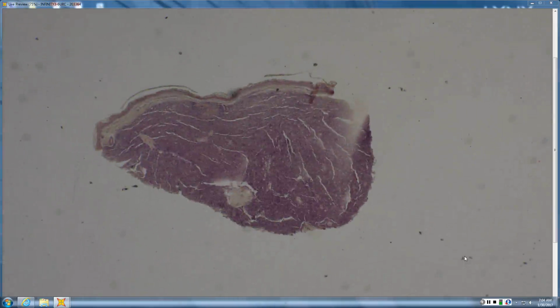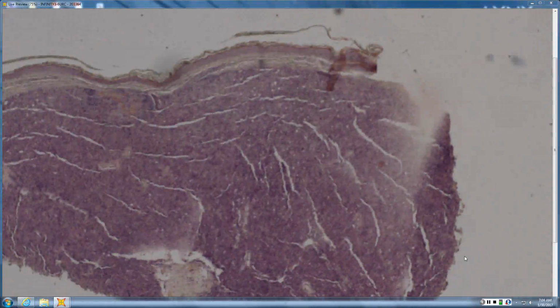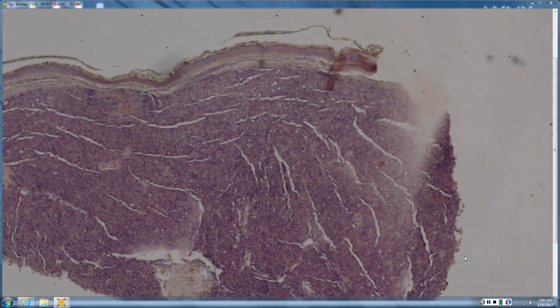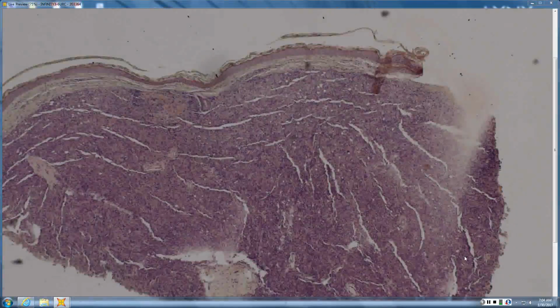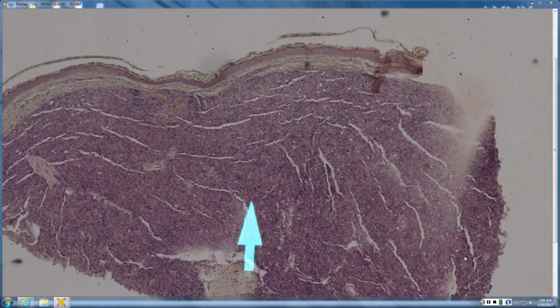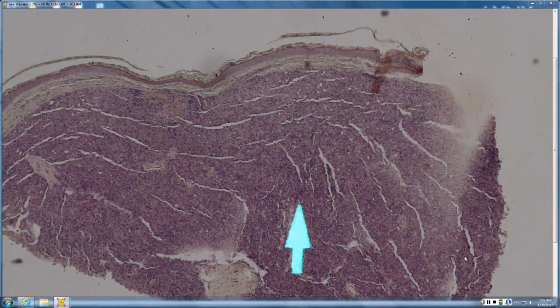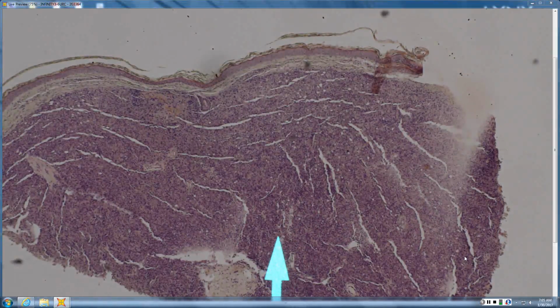So this is Leishmaniasis, and this is a great case of Leishmaniasis, meaning that you can really easily see all the organisms, but it's not always the case. Sometimes you have to search a little bit. Now, in this particular specimen, you can see why earlier I had mentioned Leish when there was that case of lepromatous leprosy with globi, because from scan, you're just seeing this diffuse lymphohistiocytic infiltrate, but then you do see some little tiny holes and little vacuoles, but even from here, they don't contain that kind of vague amphophilic material.